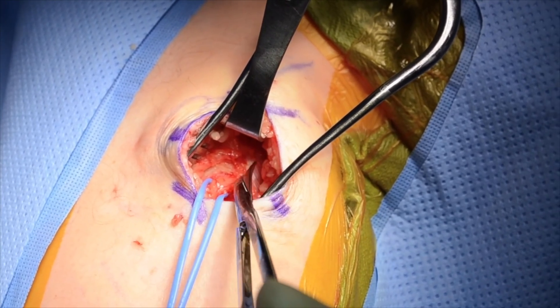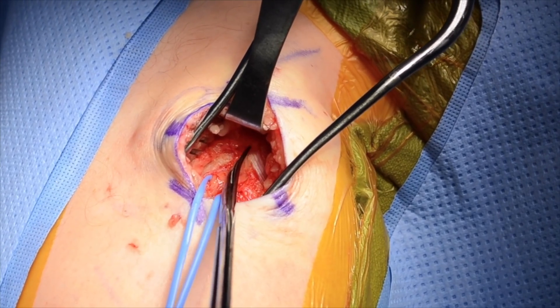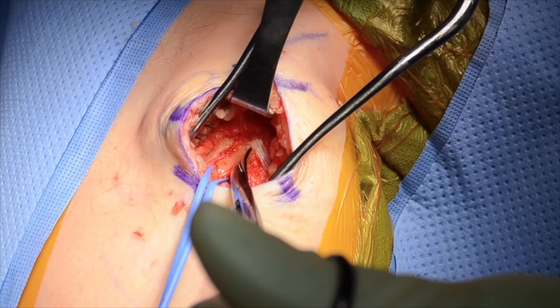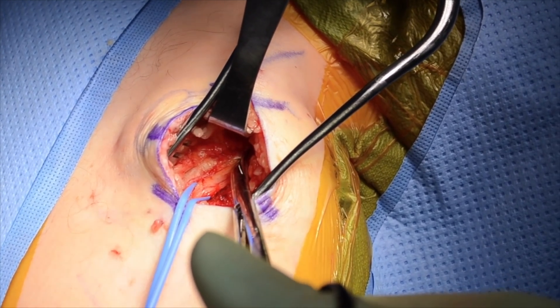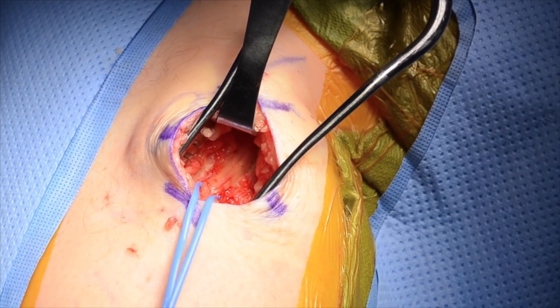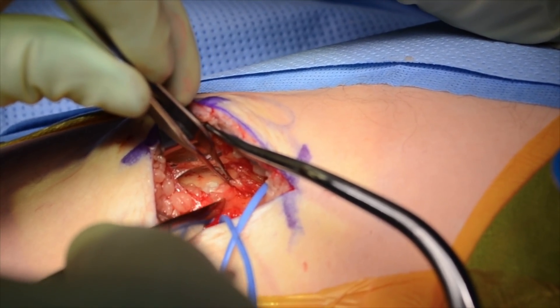This dissection is carried proximally in the leg. The nerve sheath that can be directly visualized is safe to cut, while additional nerve sheath can be divided by positioning the scissors and then pushing without closing. This allows the decompression to be carried several centimeters beyond the skin incision.